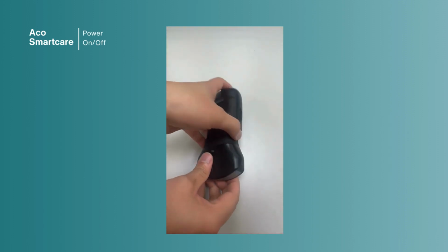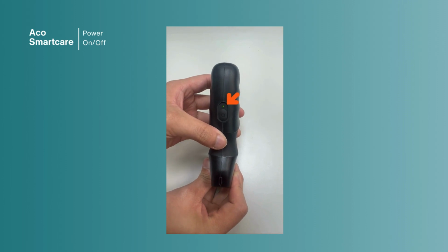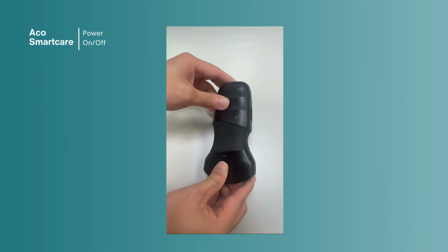To turn on the probe, press the button and hold for 1 second. The green light indicates the probe is turning on. To turn off the probe, it's the same way, by pressing the button and holding for 1 second.